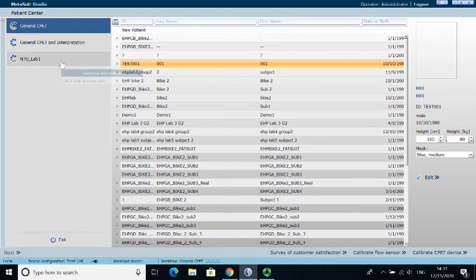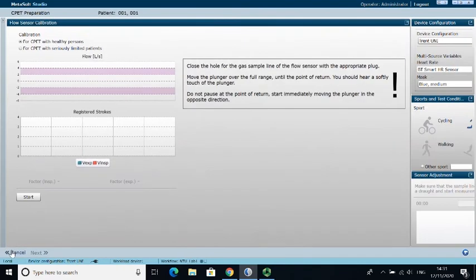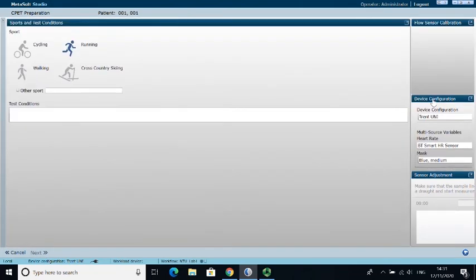So at the moment I was on test 1. That was a previous test that I conducted on Matt, and if I wanted to I could conduct another test on him by clicking that button and then taking it through into the next setting, which is what I've done here. So now in this particular screen, because I've already selected my participant and I've already selected the test that I want to run, so that's CPET 1.